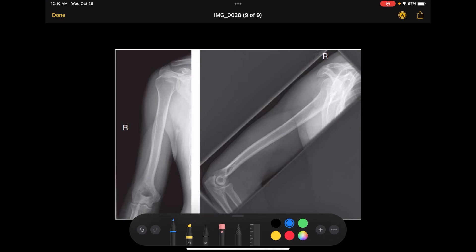It's okay if the elbow joint is slightly distorted, just because of the divergence of the beam. It's not going to be a perfect elbow x-ray, but you do want to make sure that you include the entire elbow joint.